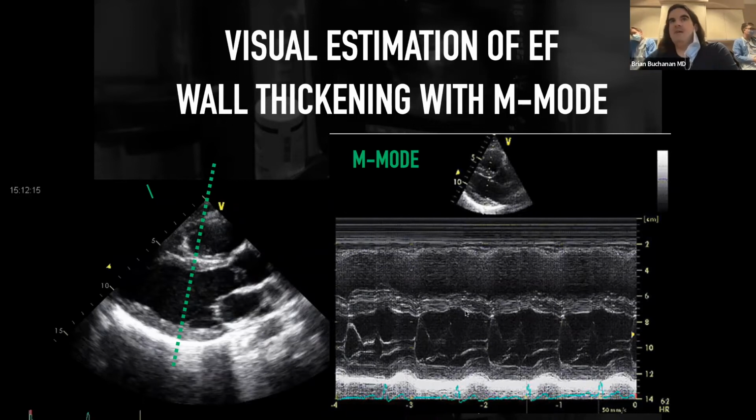Now we compare cavity volumes in diastole versus end systole. But generally M mode is not commonly used that often anymore for assessing ejection fraction. It's more quantitative methods, and frankly, it's more just visual assessment than it is M mode.